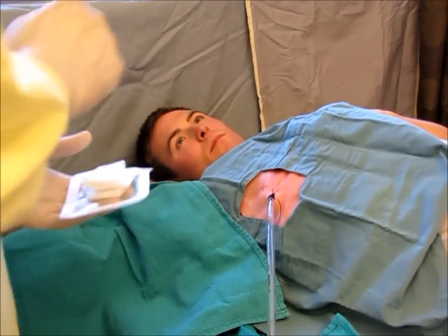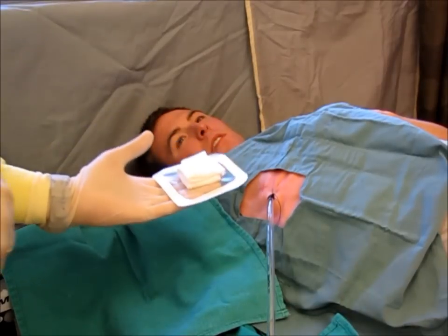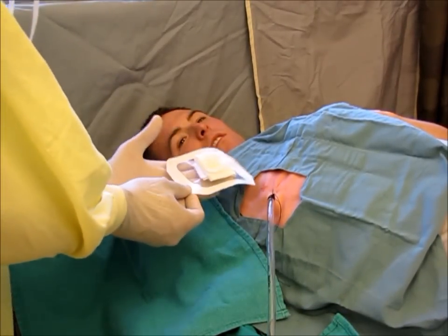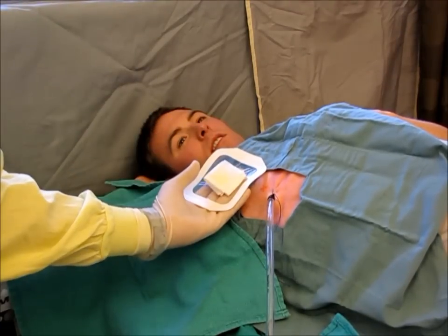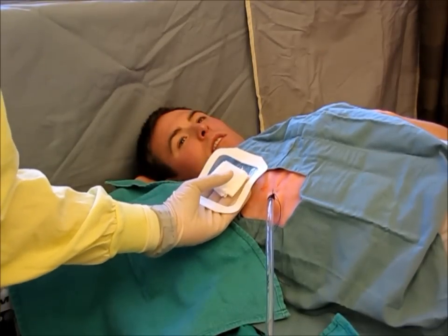When ready to remove, with the occlusive dressing in your non-dominant hand, have it ready directly by the incision site so that the moment the chest tube is released, you can put pressure and occlude the incision.